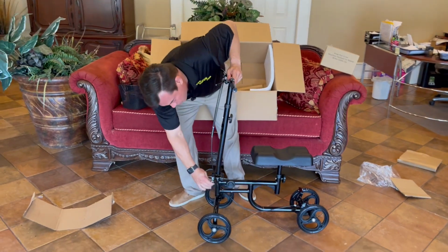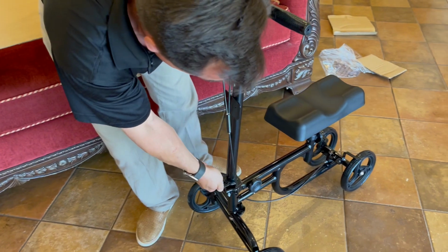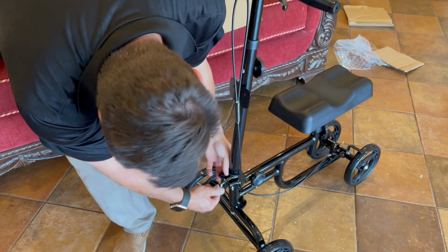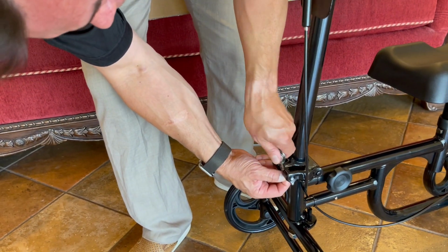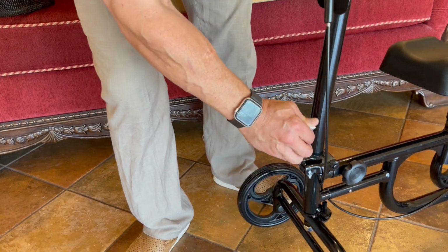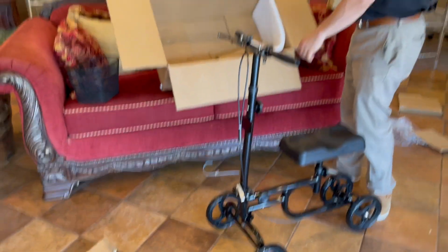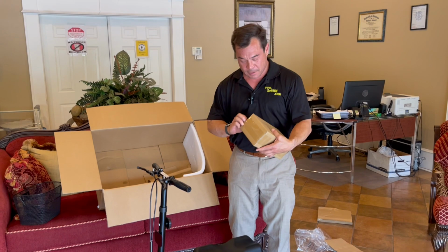Last but not least, this is just the basic for getting this started. We're going to put this and pop this up. It may be a little tight because these new ones are a little bit tight, in which case you just take and loosen that little nut there until it fits on and lock it down. Makes it nice and tight. Now, we have here more stuff.